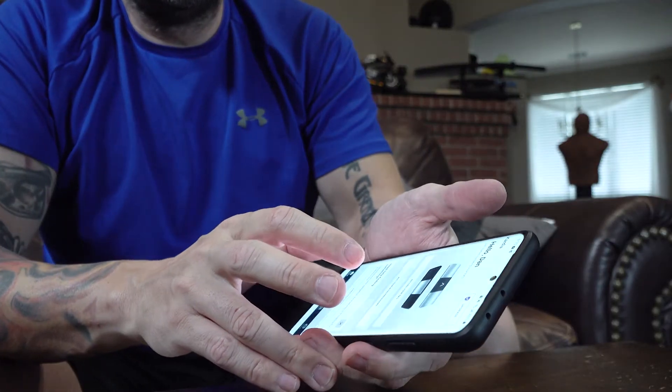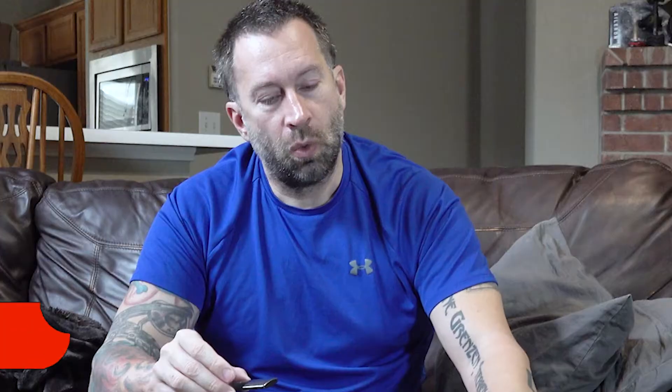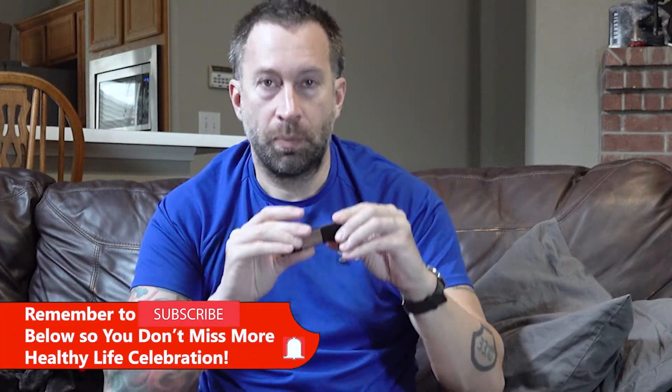The way to use this device is through your phone app — you go to the app and log in. Once you're in, there are a couple of ways to use it. You can see there are three silver parts to the device and a battery inside that you may need to change if you use it enough. It Bluetooths to your phone, so you'll set up connectivity when you start — it's not hard, it's actually a really easy device to use. It recommends a couple of different methods: one is on your knee, which I've found most useful, and the other is down on your ankle.